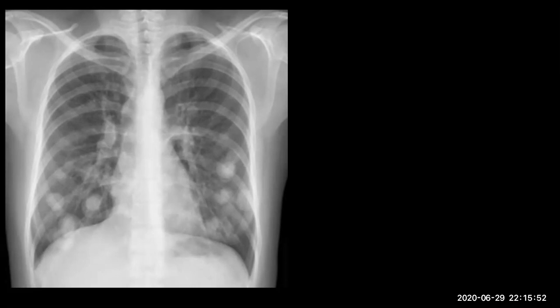Differential diagnosis for multiple well-defined pulmonary nodules: metastasis. Okay, one of the differentials. Multiple AVM. Metastasis from where? Most common metastasis to the lung, breast. Prostate. Can be breast here. No, it is male, no breast shadow. Okay, other differentials.